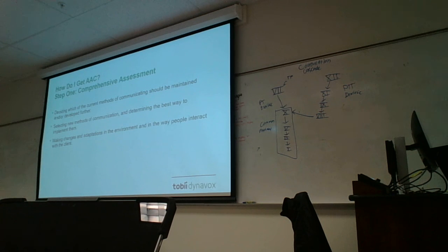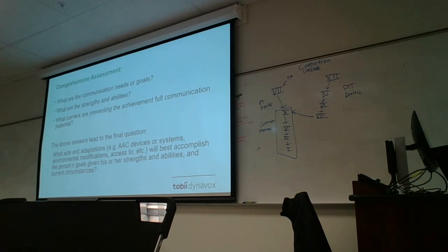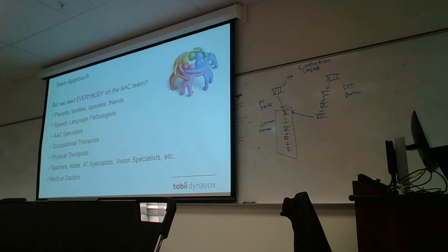So who's ready to try some devices out here? Any questions about funding? It's something that you'll definitely cover, like I said. Yeah, we'll circle back to it again, but just to explain a little bit so you're aware of the steps.